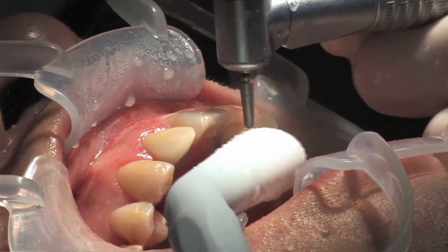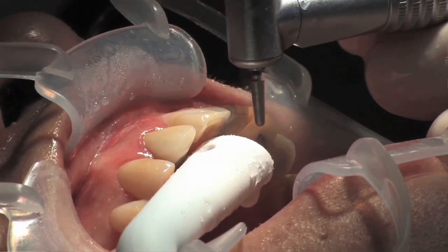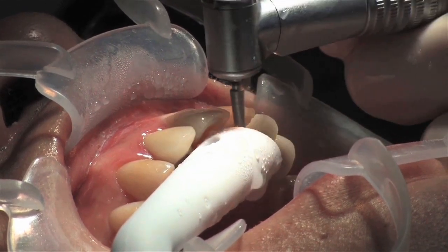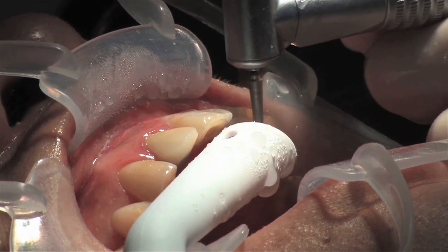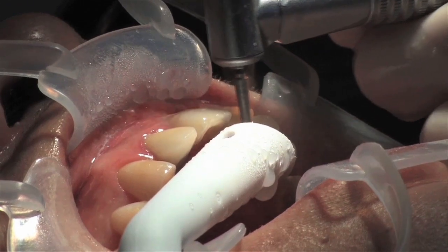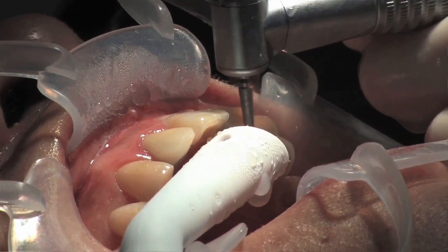And because of the position of the depth cuts and the depth of them, it kind of forces the preparation to end up being the right shape to be properly reduced and to have a nice margin. Because I've always admitted that I have a very average set of hands, this acted like a roadmap or a GPS for me. Simply by going by the depth cuts and doing all the reduction around the depth cuts, I've ended up with really nice preps with good margins on it, but not because of any increase in skill in my hands. It's just kind of following this cookbook technique.